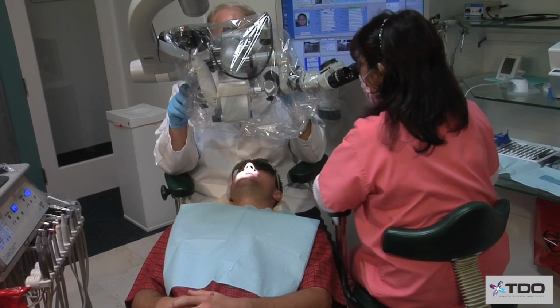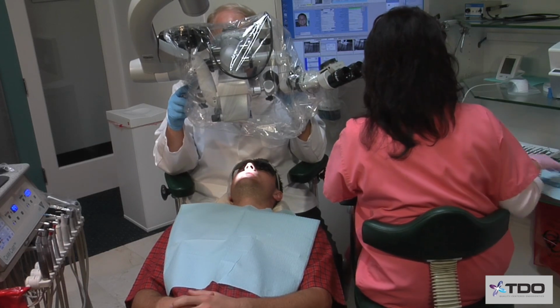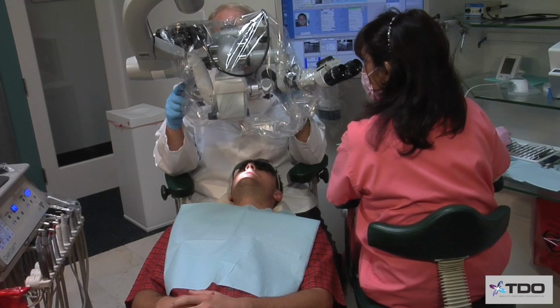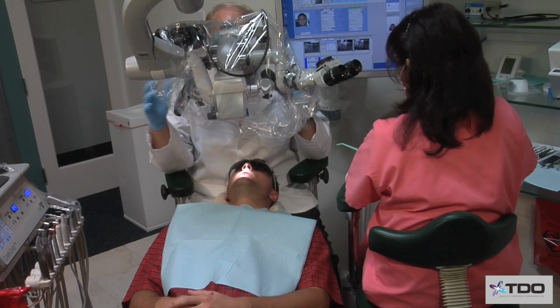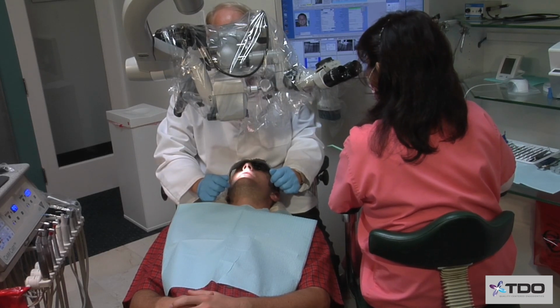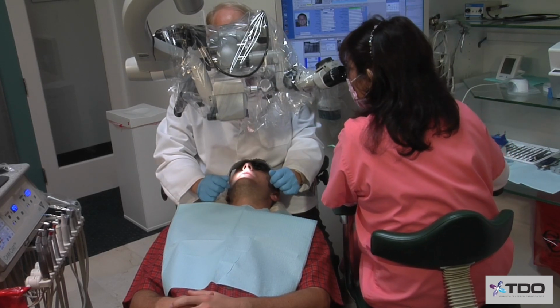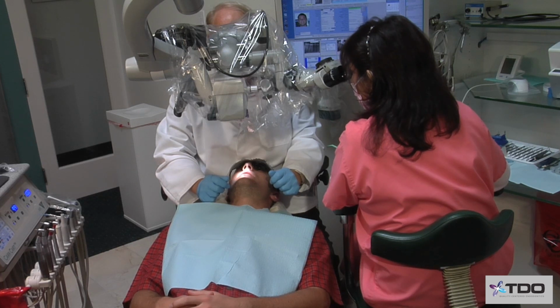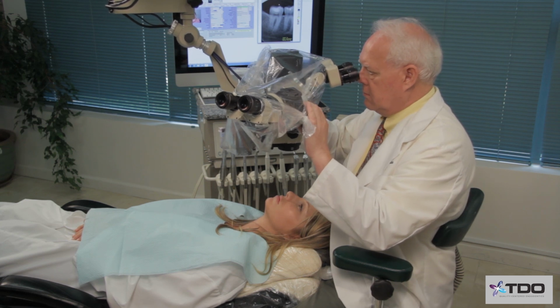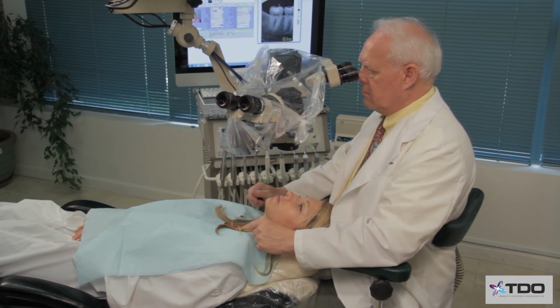We learned very early in the process that moving the scope, changing positions, altering scope angulation, all these approaches decreased efficiency dramatically, and clinicians who work this way today never really get very good at microscopic endodontics, despite the self-promotional claims to the contrary. The key components to operating this way are this.